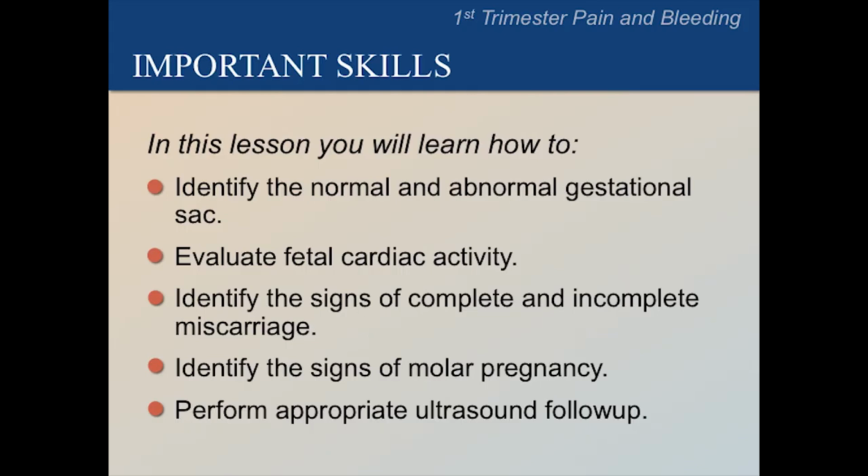5 main skills you will learn in this lesson. You will learn how to identify the normal and abnormal gestational sac, evaluate fetal cardiac activity, identify the signs of complete and incomplete miscarriage, identify the signs of a molar pregnancy, and perform the appropriate ultrasound follow-up.